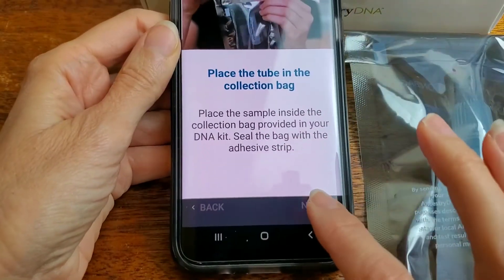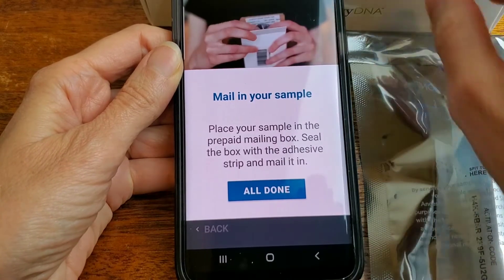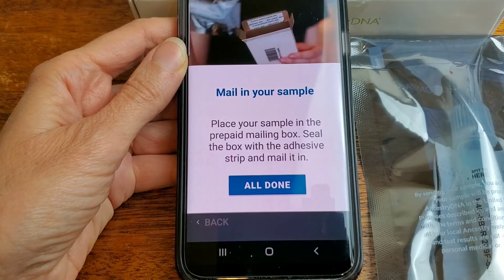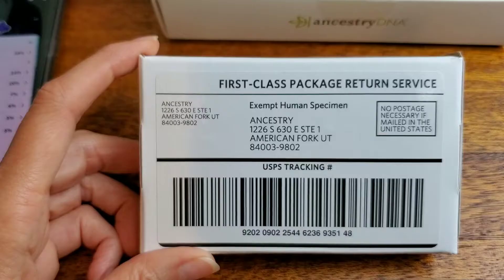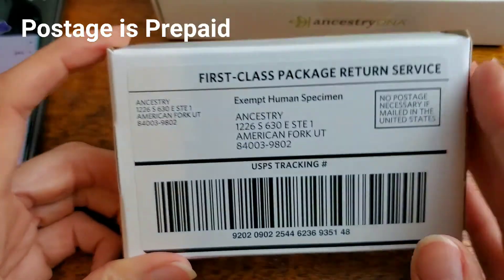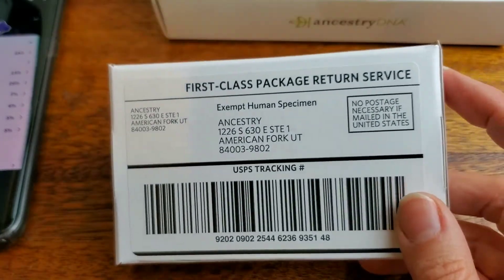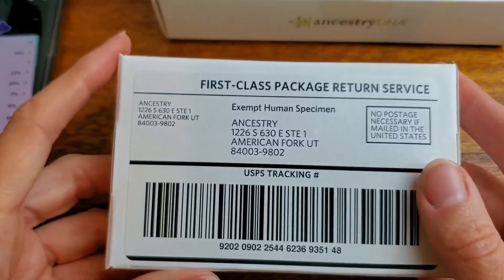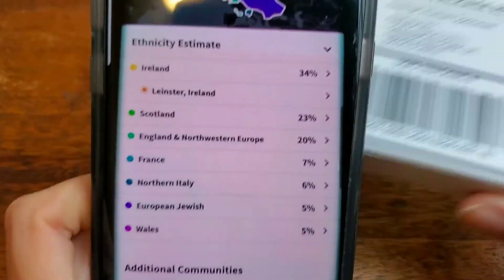Next. Mail in your sample. Place your sample in the prepaid mailing box. Seal the box with the adhesive strip and mail it in. So that's all there is to it. I put my test in here — had to squeeze it in there. And if this doesn't fit in my outgoing mailbox, I'm just going to drop it at the post office.